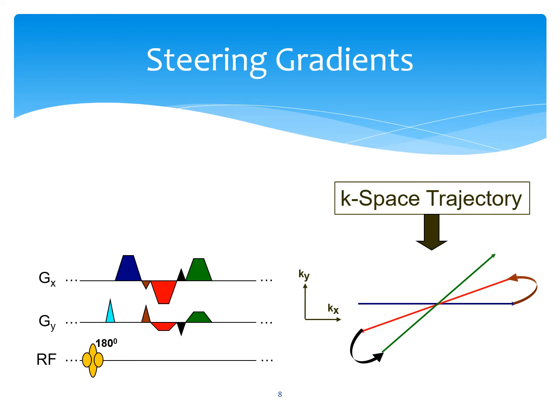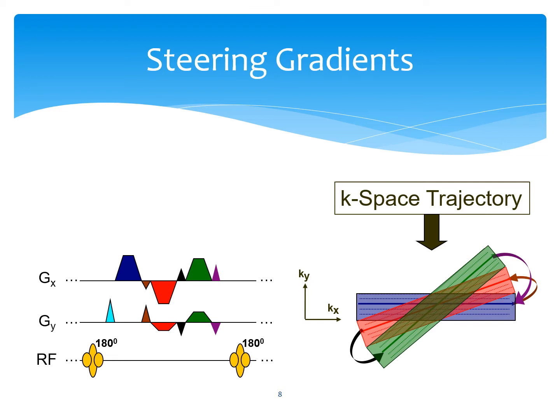Before the next subsequent refocusing RF pulse, a rewinding pulse is designed in order to bring the phase back to the KX-KY direction to satisfy the CPMG condition. This completes the single spin echo segment and completes the acquisition of 3 lines of K-space within the spin echo. As we move through subsequent spin echoes, similar additional lines for each of these 3 blades are acquired. Eventually, with the end of the TR, 3 entire blades are completed.